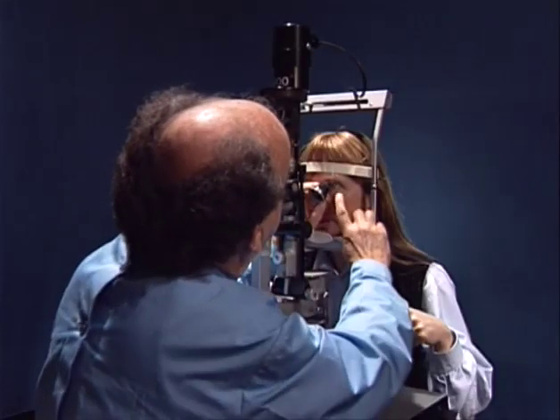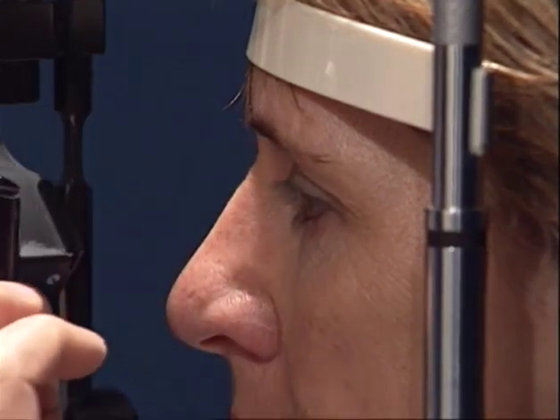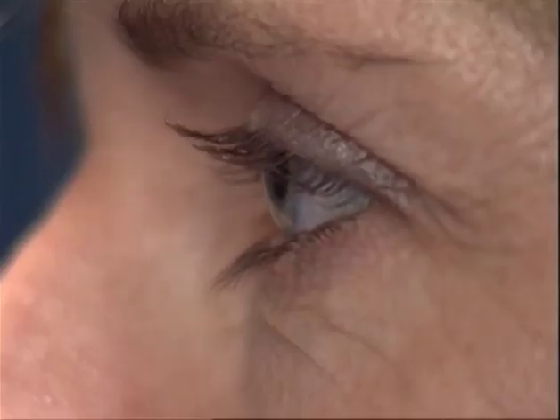When inserting a contact glass, the main task of the examiner is to avoid any direct corneal touch with the rim of the contact glass cavity, which might damage the corneal epithelium. To avoid touching the corneal surface, the rim of the contact glass is first opposed to the sclera.